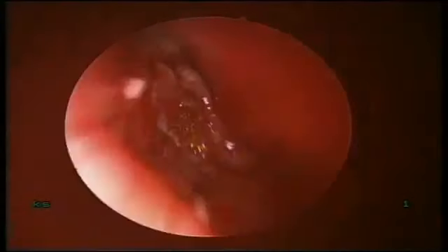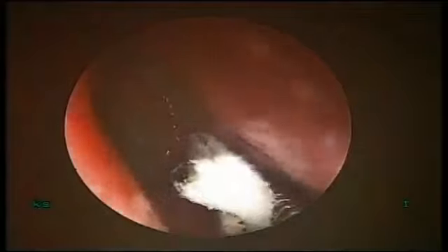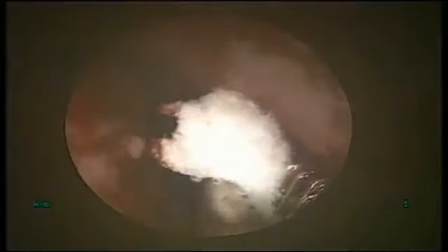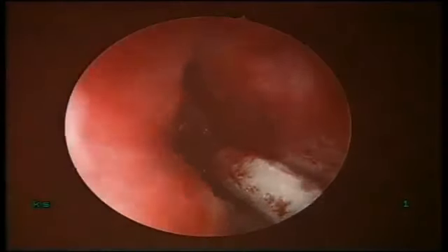See now? This is to hold the anterior flap. Okay? Yes, sir. The gel foam will lead to adhesion. Yeah, this will keep the raw surfaces in position. The blood and the gel foam is going to act as a glue. Now this piece for the upper part of the flap.